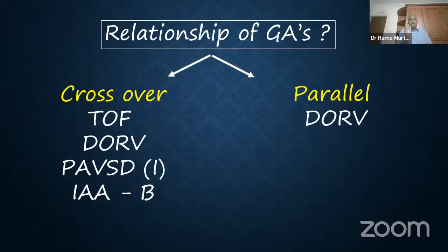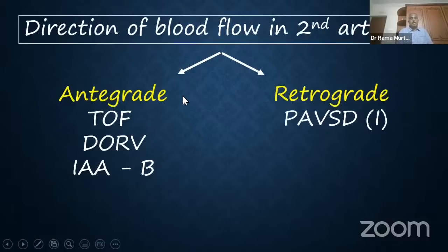It is not one kind of a relationship of the great arteries and of the overriding and of the calibers that we see in DORV. So crossover and parallel. So these are the questions that we must answer. And when you turn the color Doppler on, what is the blood flow in the second artery? In the overriding artery, it's easy to understand. It is committed to both the ventricles. The ventricles are pumping into it. It has to be antegrade.